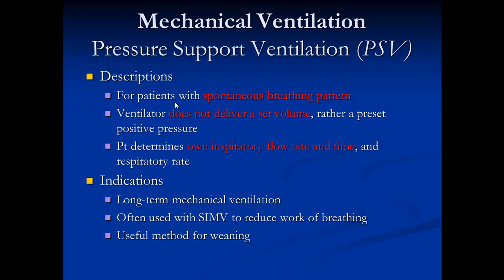The set amount of pressure support that is applied augments each patient breath. All breaths are flow cycled with pressure support. The patient controls its respiratory rate and exerts strong influence on inspiration, expiration, flow rate, and tidal volume. In addition, the delivered tidal volume is influenced by pulmonary compliance and resistance.